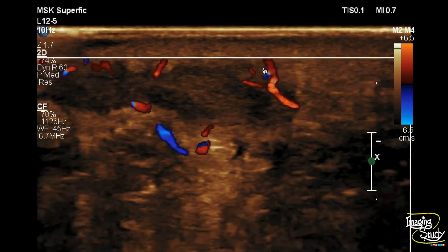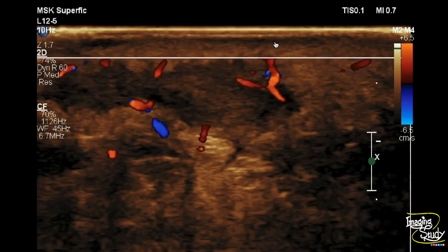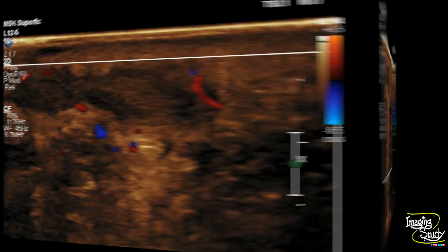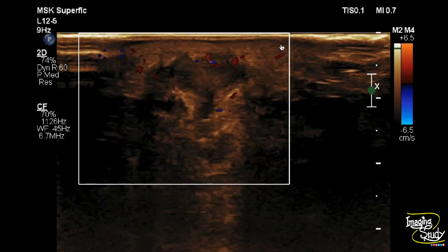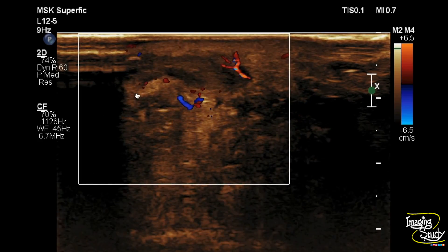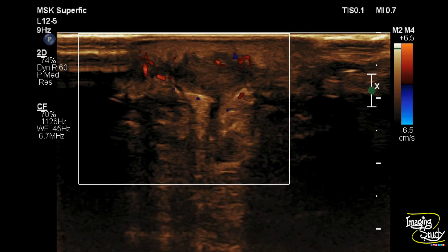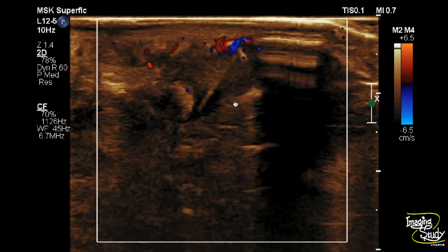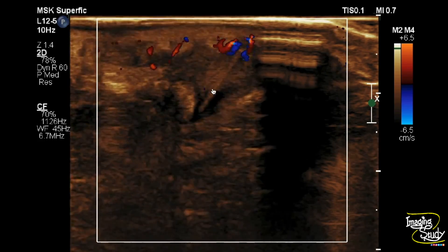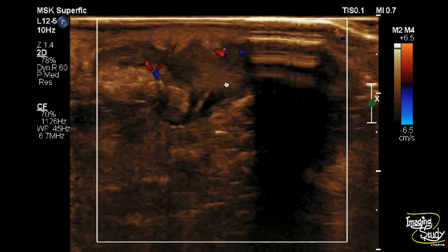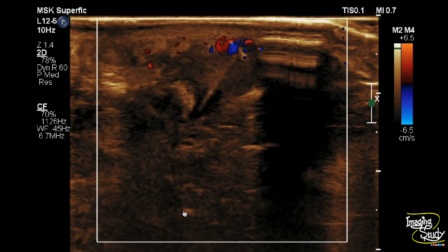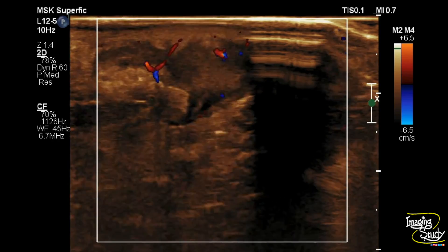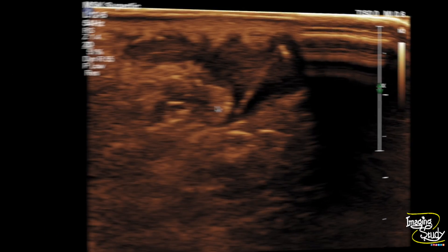When we apply color Doppler, you can see there is increased peripheral vascularity, indicating surrounding inflammation. Here's another view — you can still see high vascularity surrounding the lesion, indicating inflammatory change. You can still see this fish bone within the abscess cavity, which shows peripheral high vascularity but no central vascularity, as the abscess cavity contains dead tissue.